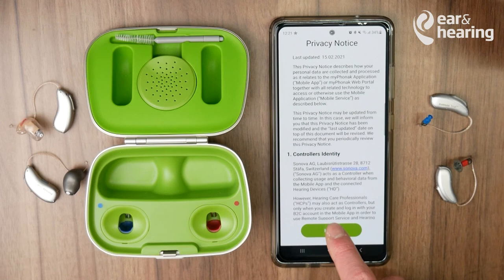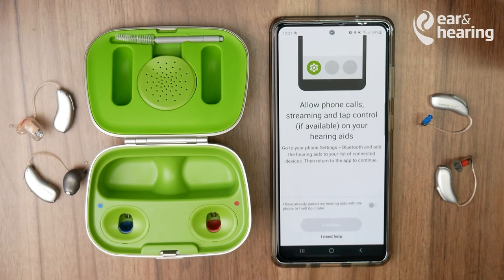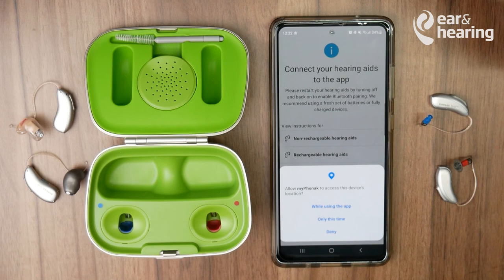Press I Agree to the conditions. If you followed the pairing procedure before, your hearing aids should already be paired — press Yes, then Continue and Continue.